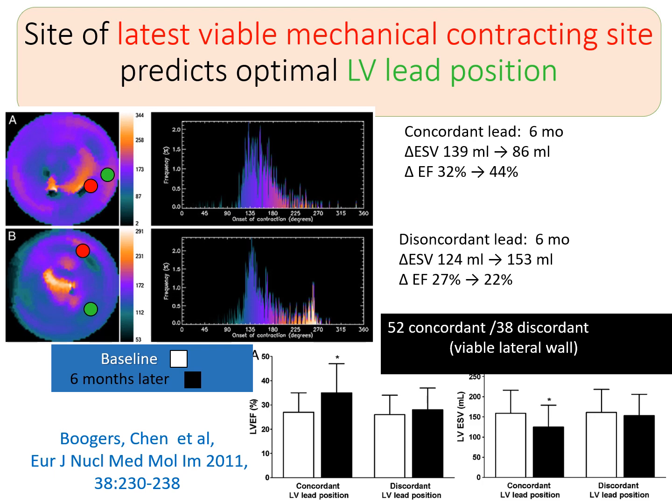So here we're looking at two patients, where the latest viable contracting site, compared to where the lead was placed, are concordant.